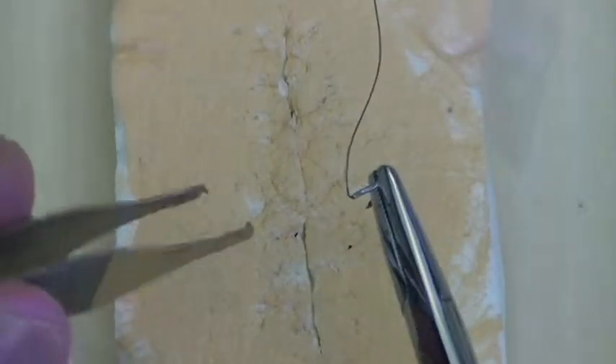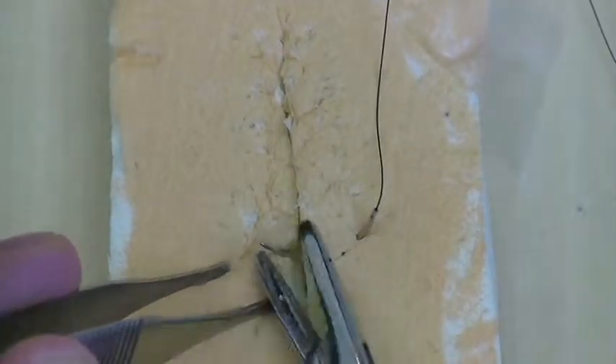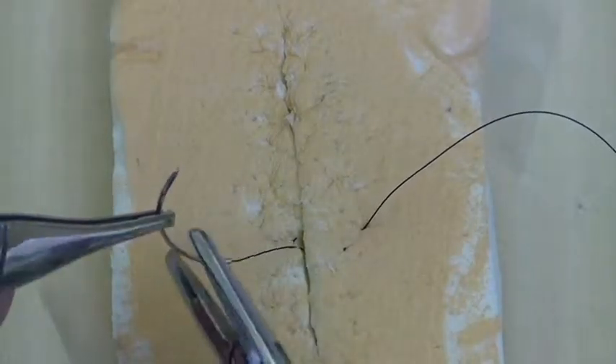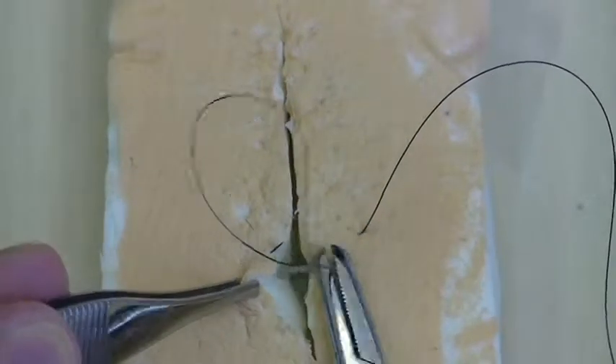So you grasp your stitch. First thing you're going to want to do is go far — far from the skin edge. You start far away from the skin edge. I'll take this in two bites because this needle's kind of small. This is 3-0 nylon. And then go far here.